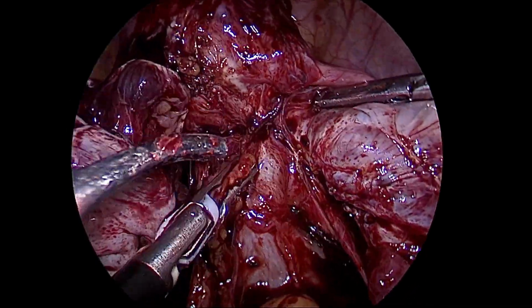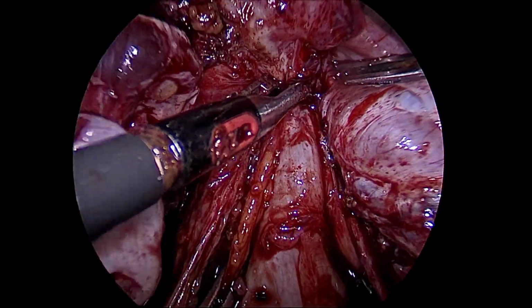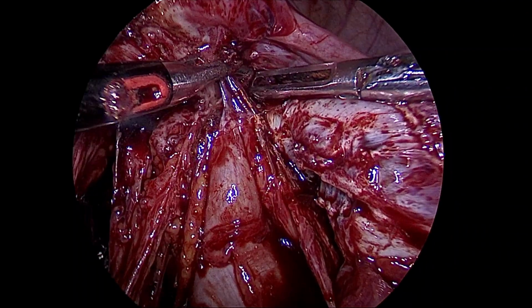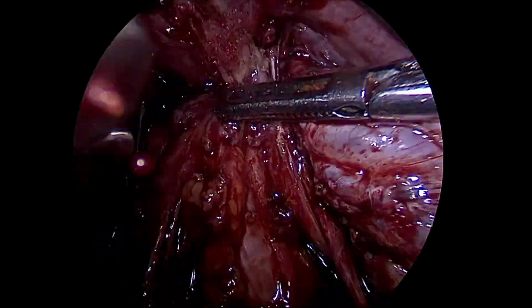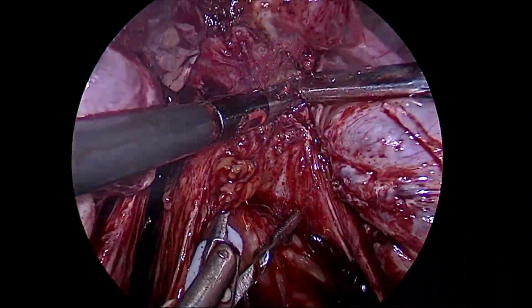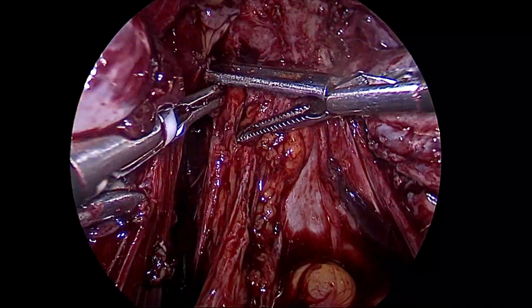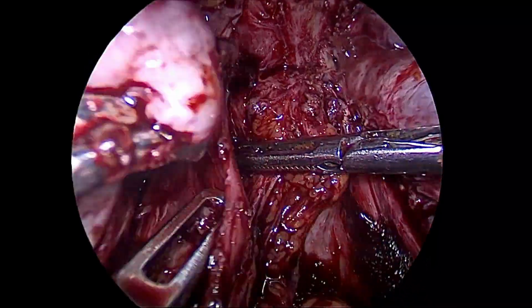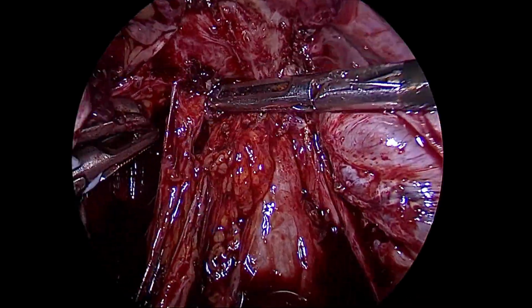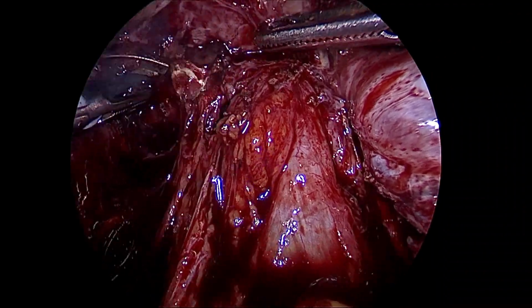Similarly, what we did on the left side, we will now be doing it on the right side as well of the patient. These adhesions which are there will be dissected with bipolar shearers, and the anatomy we will attempt to restore. We need to keep in mind to have a fantastic assistance, to have a good camera system which gives a good image, thereby having minimal complications during the surgery.